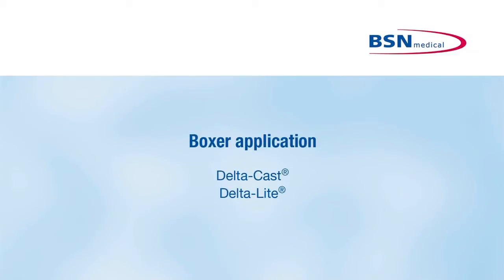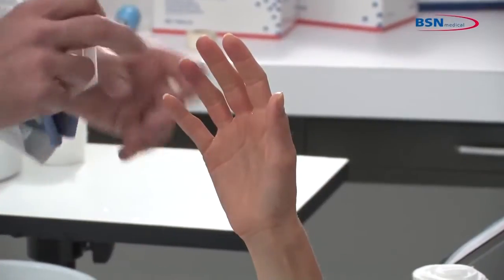The Boxer Application. For indications where immobilization of the metacarpals and wrist joint are required, position the limb before starting the application.